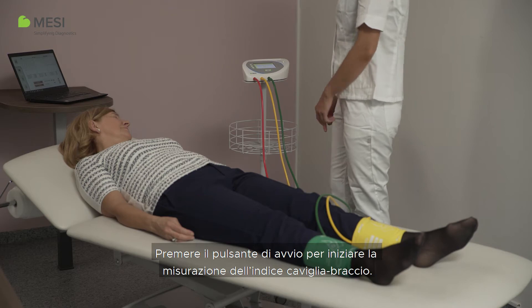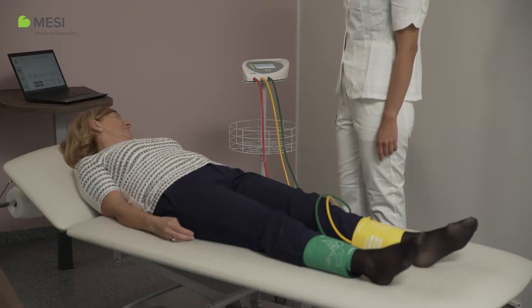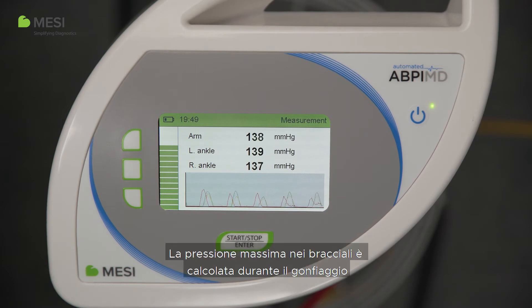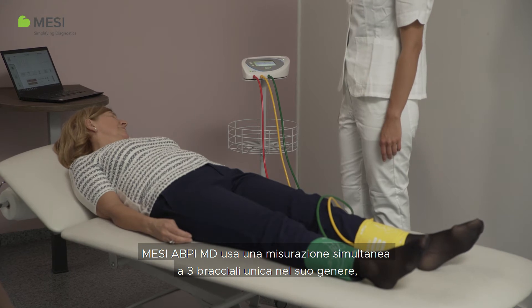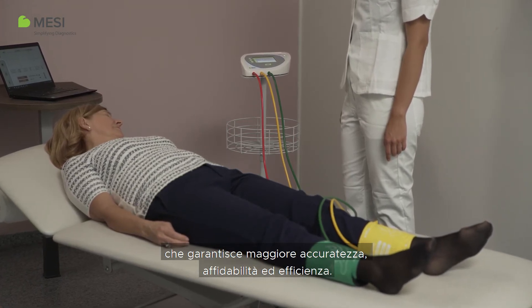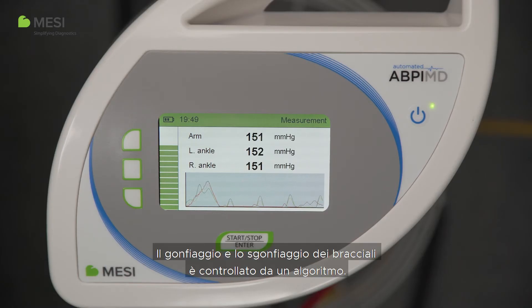Press the start button to start the ankle brachial index measurement. During the measurement, current blood pressure and pulse waves are displayed. The maximum pressure in the cuffs is calculated during the inflation and therefore varies from person to person. The MISI ABPI-MD uses a unique three-cuff simultaneous measurement which provides higher accuracy, reliability, and efficiency. The inflation and deflation of the cuffs is controlled by an algorithm.